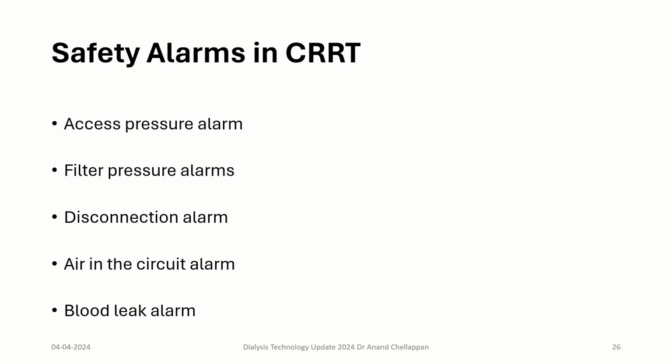Whenever the safety limits of the pressures are crossed, these alarms ring and alert the personnel who are performing CRRT, and appropriate troubleshooting measures should be taken. More on the safety alarms and how to troubleshoot each of the alarms shall be discussed in the workstation.